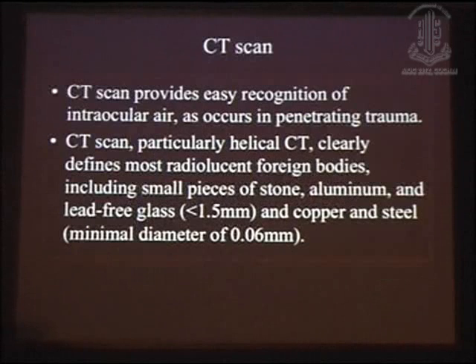So sometimes in this penetrating injury, you may confuse air with the intraocular foreign body. These are the multiple high reflective echoes. After say 1 week of that, if you repeat this ultrasound, you can see diminution of these high reflective echoes. It shows the presence of air inside the intraocular region.